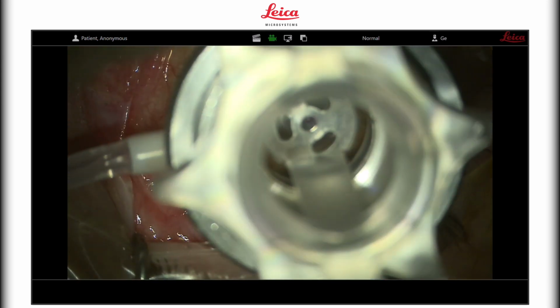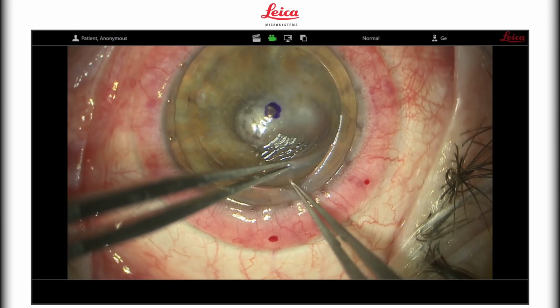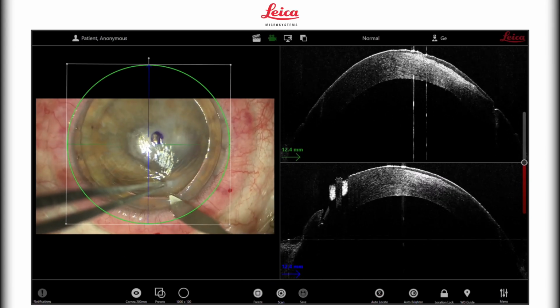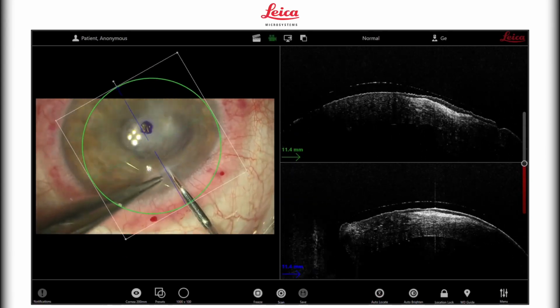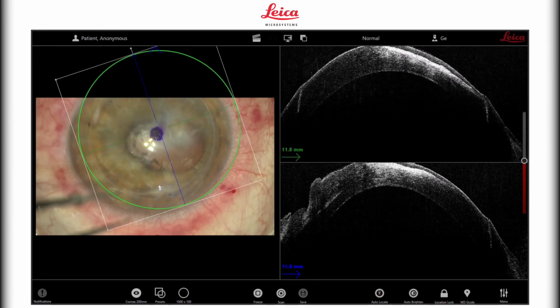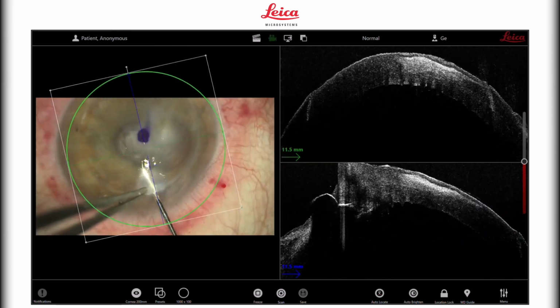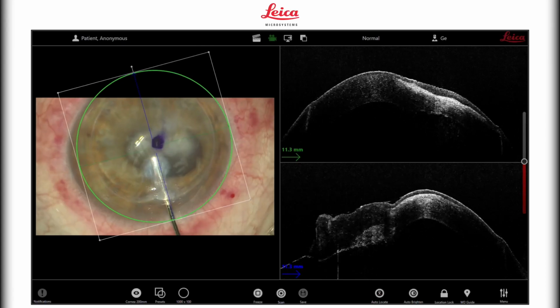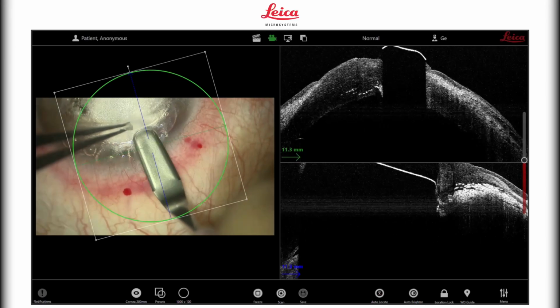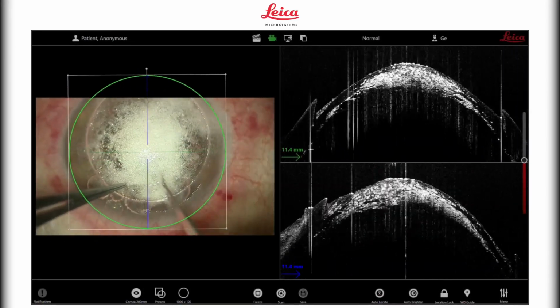So I perform as usual my partial thickness trephination, and I inject air anyway in order to cause an emphysema inside the stroma. And why is that? It is because when the stroma becomes white, whatever is white is stroma, whatever is not white and is transparent is a Descemet membrane. So I can recognize where I am, okay? So here is air injection. I do not want to, or do not pretend to achieve a big bubble in this case. I just use air as a dye in order to create this emphysema.